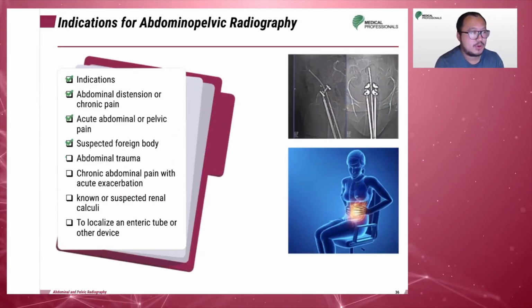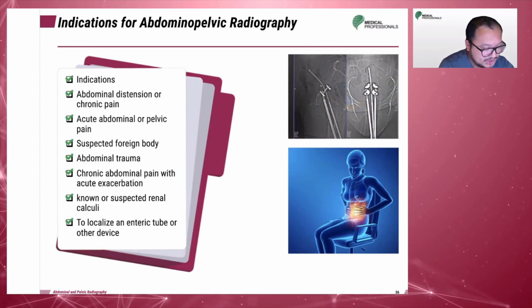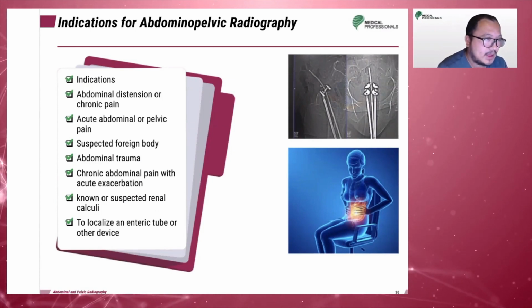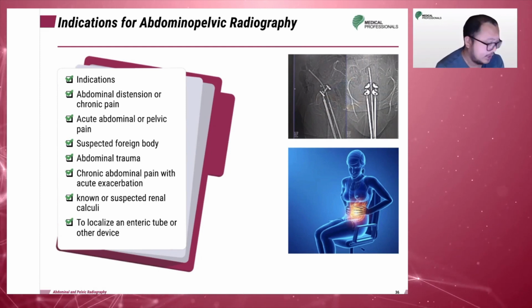All right, so what are some indications for abdominal pelvic radiographs?